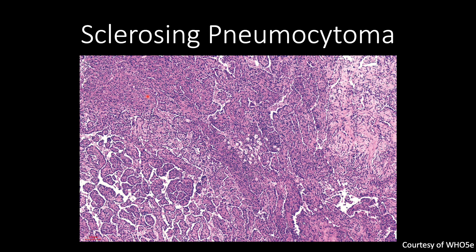Here's a low-power image of a sclerosing pneumocytoma, courtesy of the WHO 5th edition, where you have three architectural patterns: sclerotic, solid, and papillary.